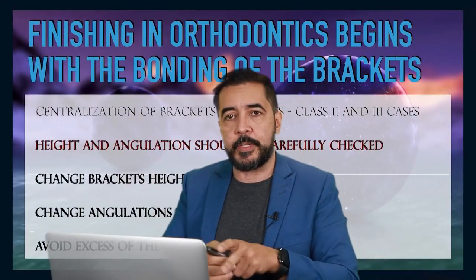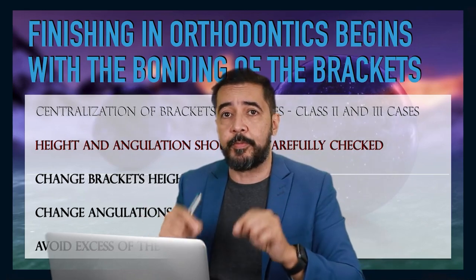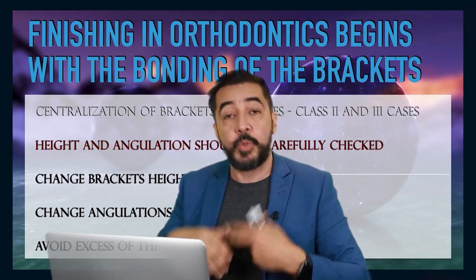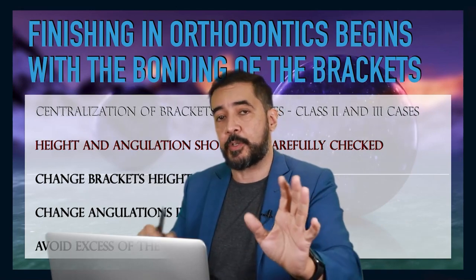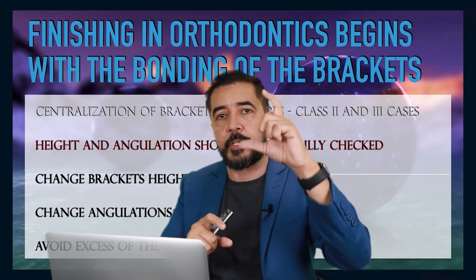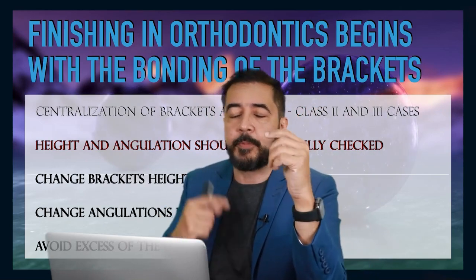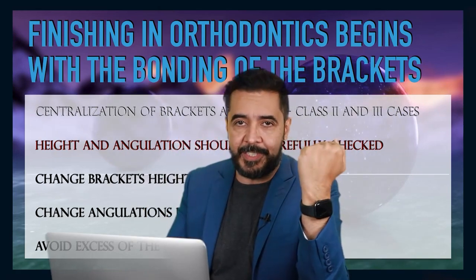So we're trying to anticipate. In the first part, we are just dealing with the positioning of the brackets and tubes in order to avoid bad positioning of those teeth that we have as a result of our bad positioning during the first part of the treatment. So now we're going to talk about the height of the position of the bracket, from the incisal or occlusal to the cervical part of the teeth, okay?